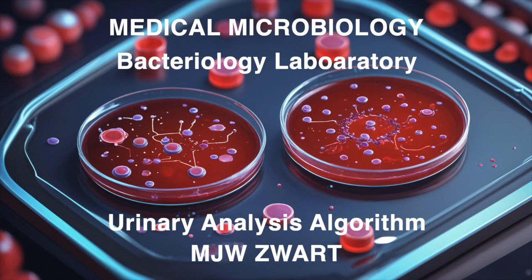3 days. That seems pretty short. Is that really enough time? For the vast majority of routine urine cultures, yes. The critical information is usually obtained within that initial culture period. Of course, there might be exceptions, like if unusual organisms are found, or if there are special circumstances surrounding the case. So it's a good guideline. It is. But there's always room for flexibility. Right. Based on the specific situation.